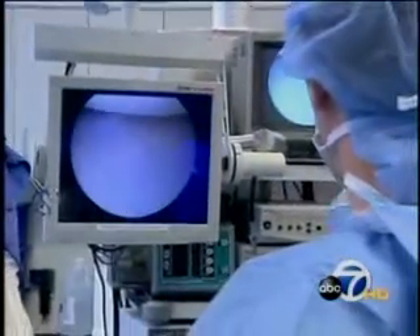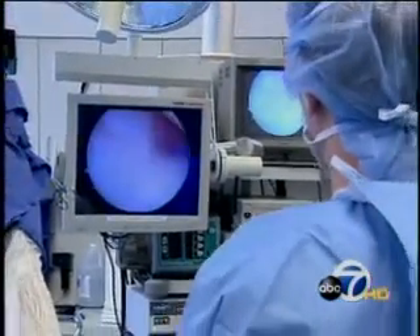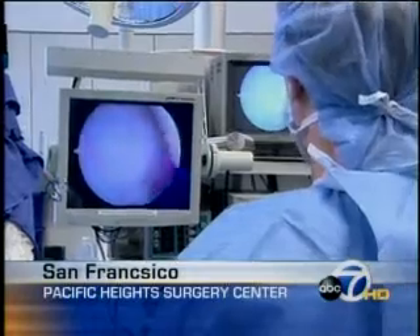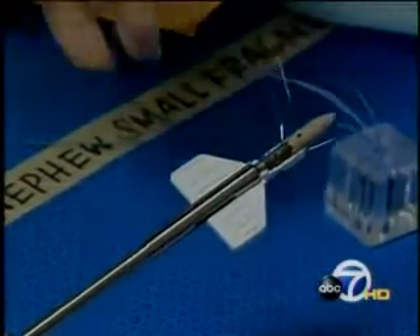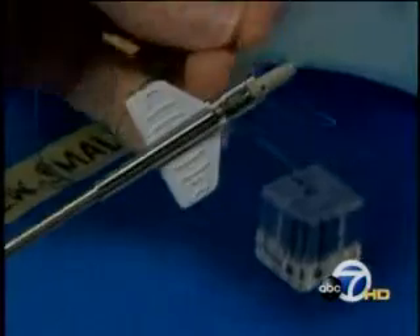We're looking at the ball and socket joint. Dr. Halbrecht begins Regina's surgery by cleaning the site where the Versalock will be implanted. Then he preloads sutures into the device before tapping the Versalock into place. It's basically almost like a rivet or a fancy staple device that allows the rotator cuff to be fixed to bone and to tension the sutures to just the perfect amount to allow compression of the tendon onto the bone.